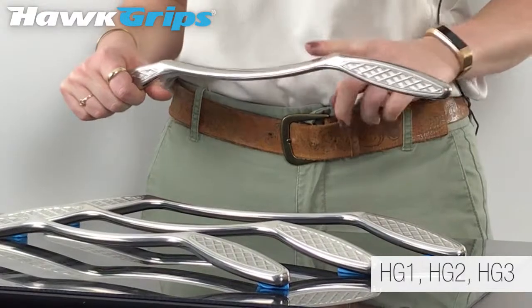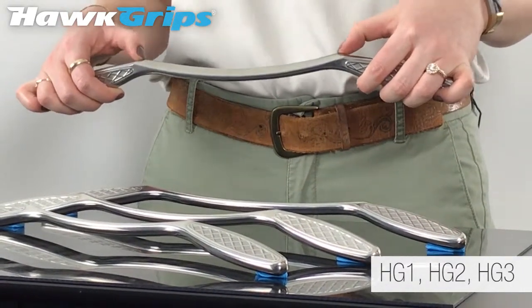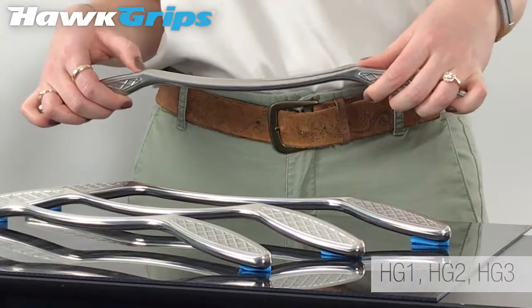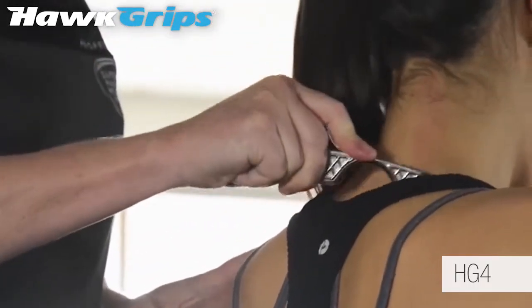It is a concave tool with a nice steep surface, so we can get pretty deep with this even though it is a concave tool. We have two nodules here for some convex point-specific work.